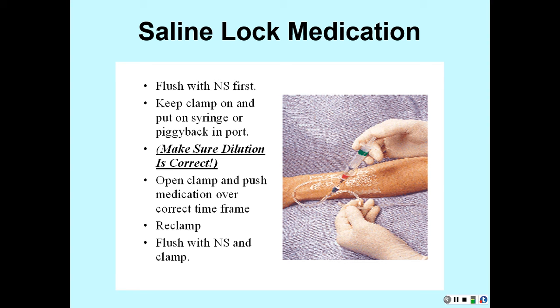Then you flush it again, and you want to flush at the end at the same rate that you pushed your medicine in. I'll say that again. When you're flushing after a medication, you flush at the same rate you gave your medication.